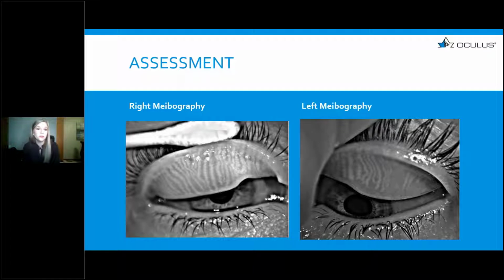And it was really telling. So looking at the glands, the right eye looked great, a little twisty turvy with some of those glands there in the middle. But if you look at the left glands, there's a whole chunk in there, about 3 or 4 glands right in the very center that are just completely atrophied or gone, okay? So I said, wow, there's your problem right there. It's always that left eye, and you're just missing a whole section of glands.